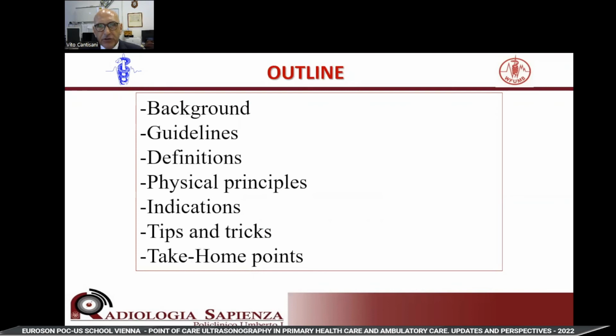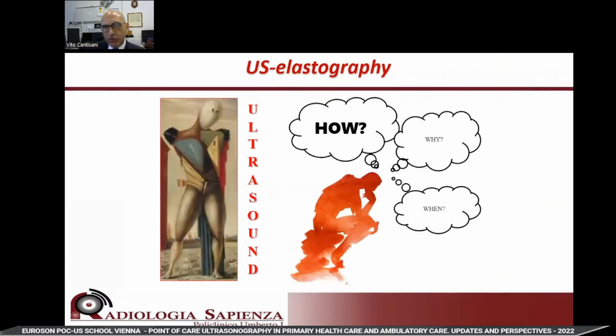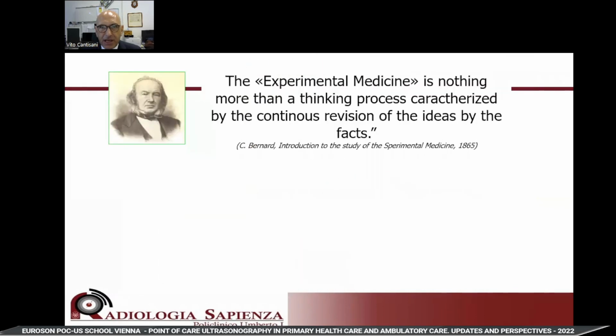Unfortunately, I will not be with you, but I will try to do my best to provide all the information necessary for introducing all of you to ultrasound elastography. I will provide to you background from guidelines, definition, physical principles, indications, some tips and tricks, and finally, take-home messages for all of you. When we deal with any kind of imaging modality, we have to ask how, why, when, and how to try to address these questions.